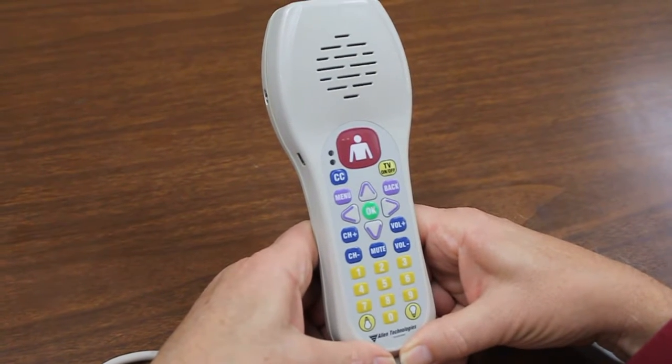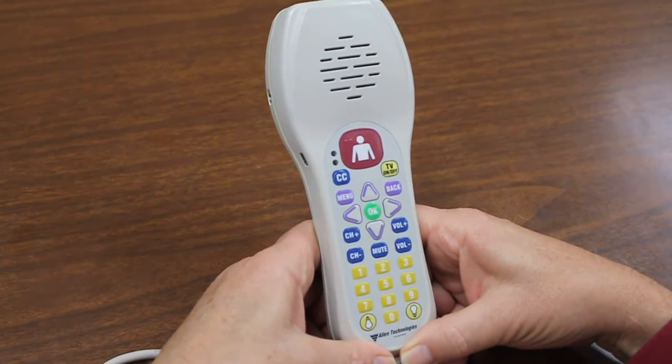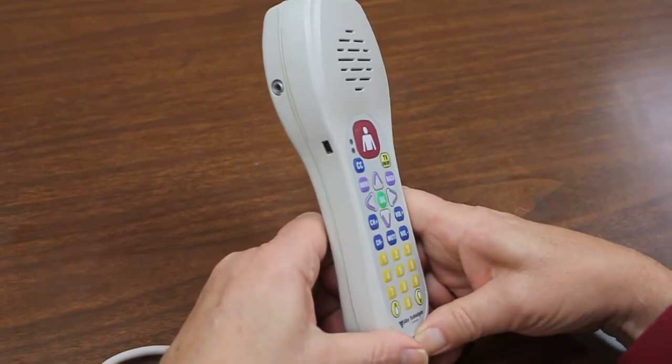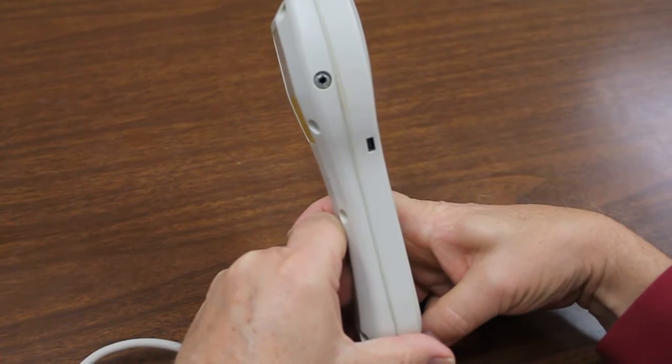I'd like to demonstrate the recommended cleaning procedure for an Anacom MedTech pillow speaker that has both a USB keyboard port as well as an audio jack.